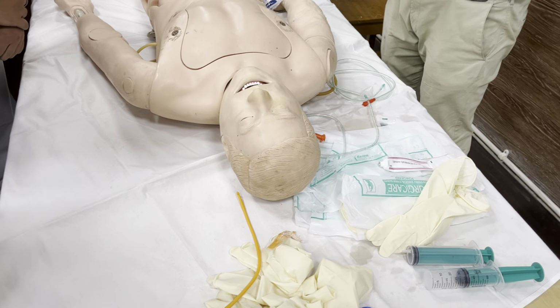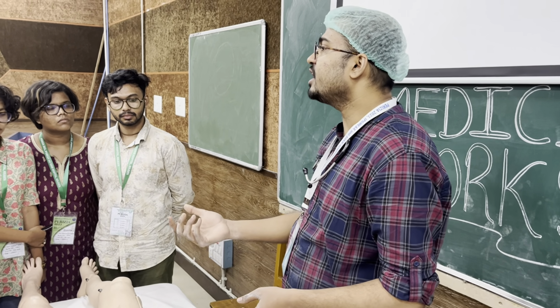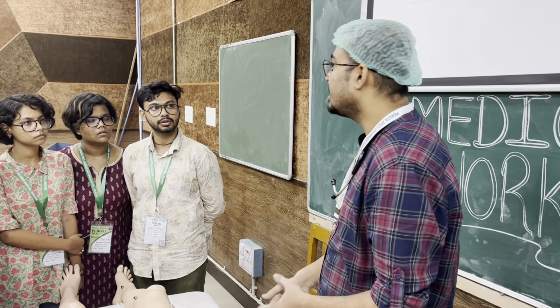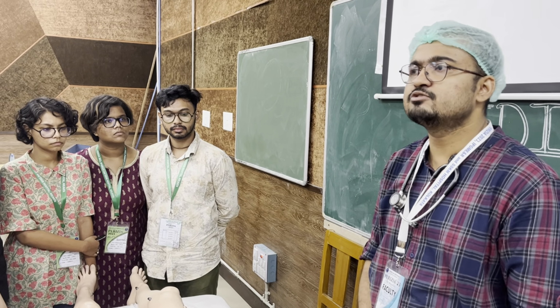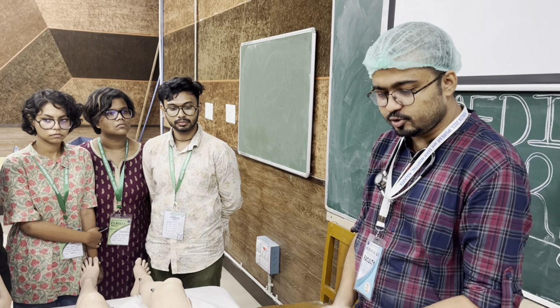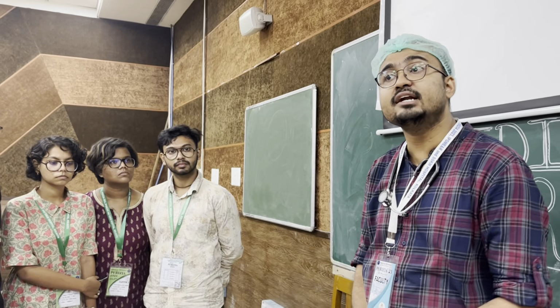Otherwise, if you try to feed an unconscious patient, there can be introduction of food into the respiratory tract. That can cause aspiration pneumonia or choking. So in an unconscious patient, you should insert one nasogastric tube for proper enteral feeding.